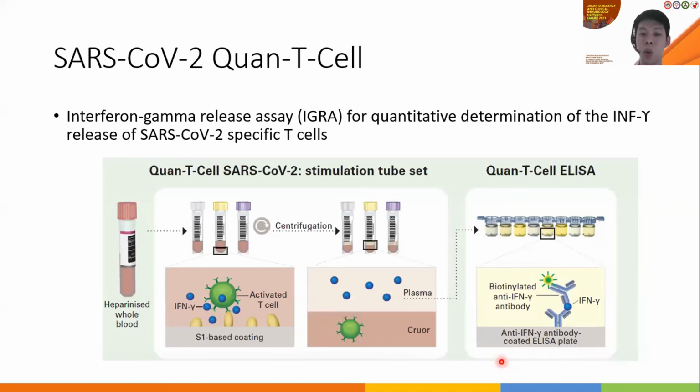Thus, this is a good way to assess people who do not have detectable antibody levels. This is an alternative testing methodology that can tell them that, although you have been vaccinated and do not have detectable antibody levels, your cellular immunity arm does work, as seen and laboratory tested using this test and technology.